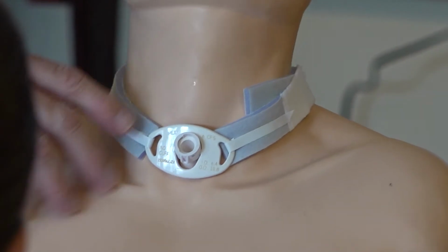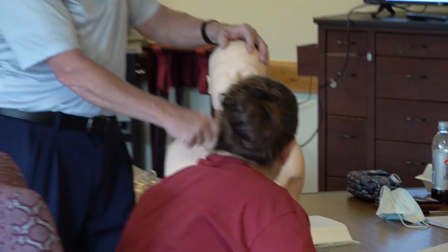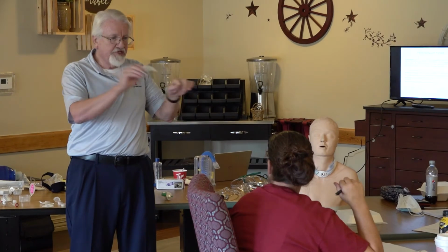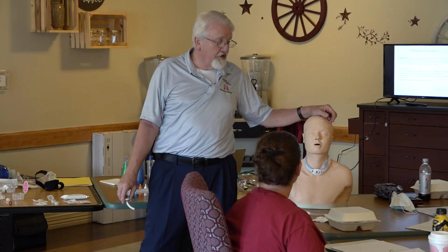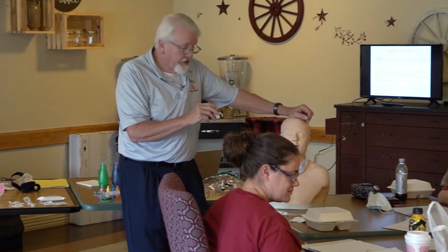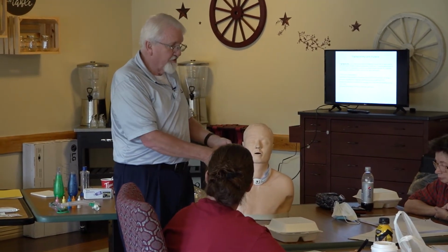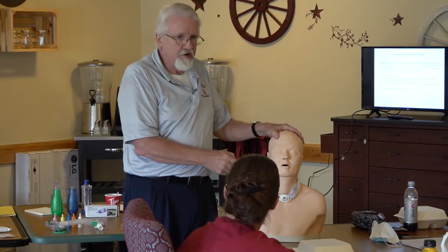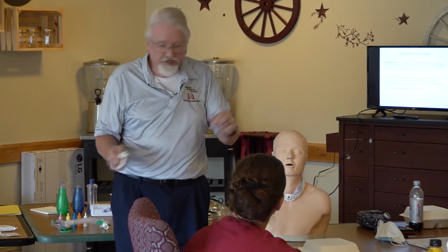Now the big thing to remember is when you're doing that, if you're not comfortable doing that by yourself, get a coworker to come in and just hold the flange for you. Because once you let that collar disconnected, remember this is just like a dipstick. If it's not connected and you're not holding it and that person goes, it just flew out. Okay? So if you're not comfortable doing that, then, because it's only going to take, even me doing it by myself took me 2 minutes? With a helper, it might take you 1. So get you some help rather than taking a chance of that working its way out while you're distracted or what have you.